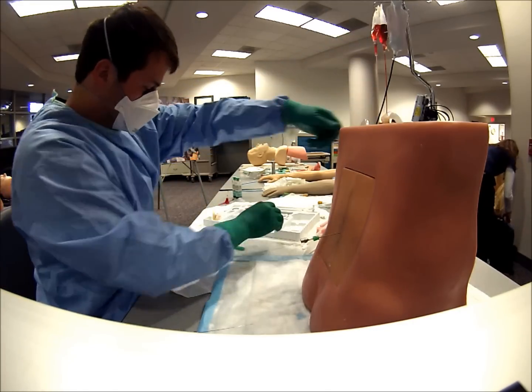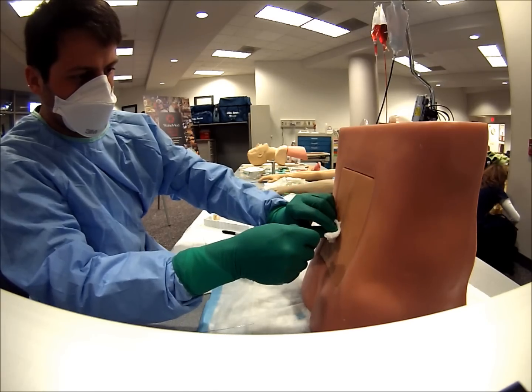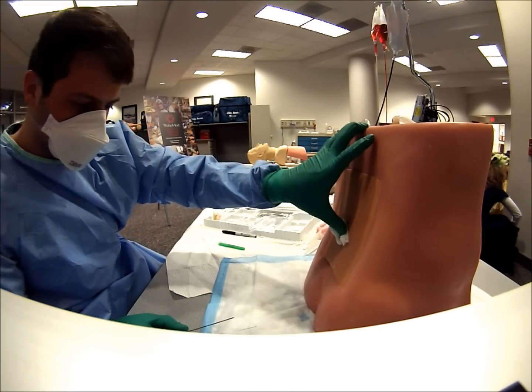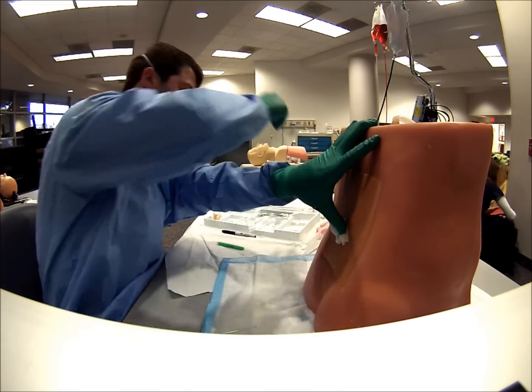After you've achieved the required amount of fluid, you're going to remove the needle in a fluid manner straight out and apply pressure with a sterile gauze for a minimum of a couple of minutes.